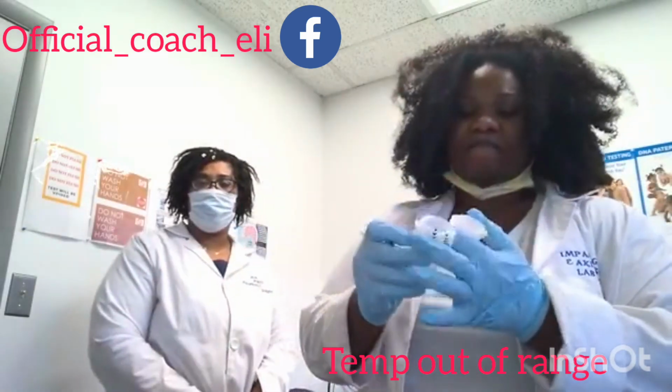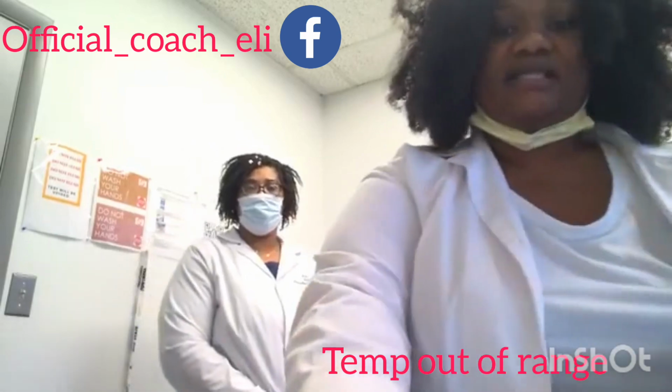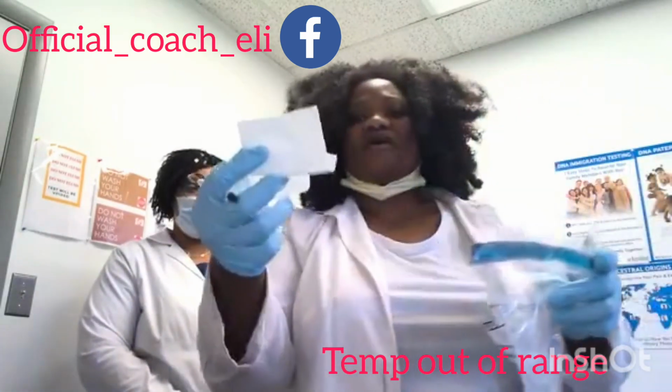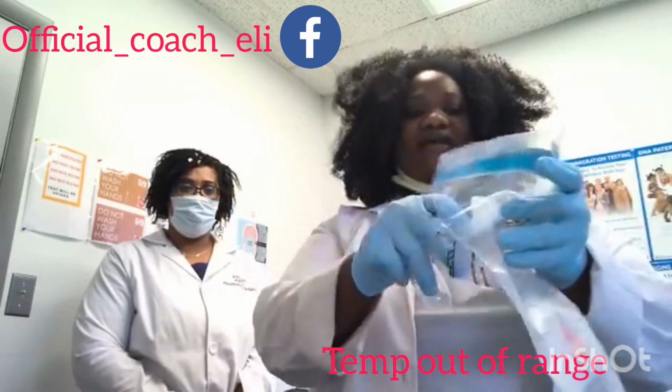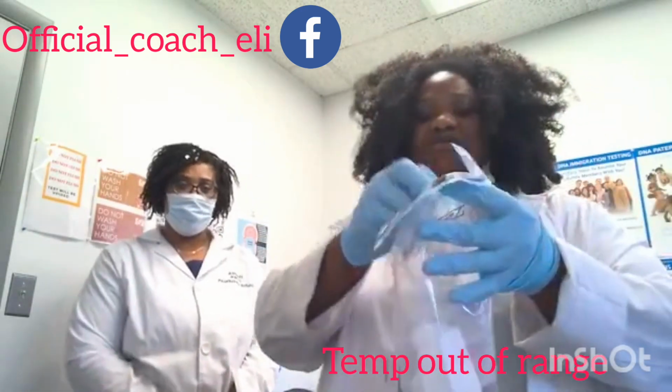All right, once that's done, I'm gonna put these 2 guys in the specimen bag, the specimen bag where it has the absorbent pad. I'm gonna go ahead and lay it down carefully to avoid spills and all that.